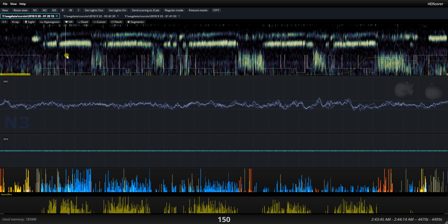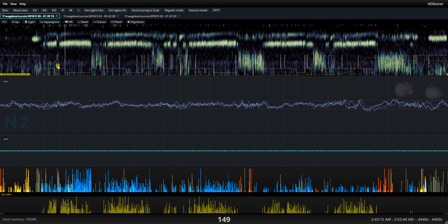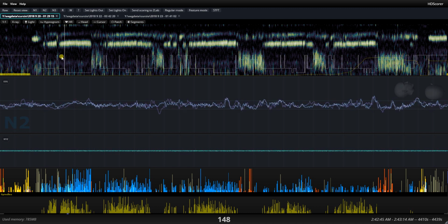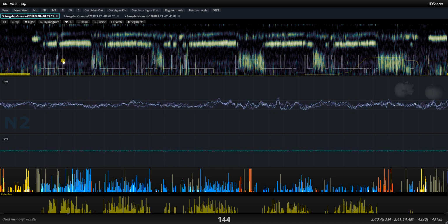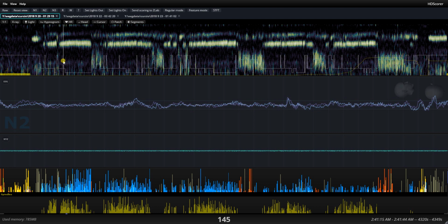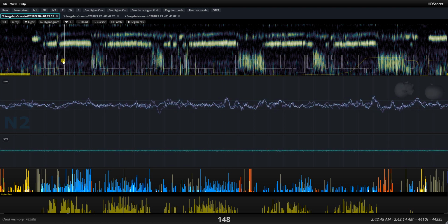Here we're in a transitional phase. This should be a smooth line here. Definitely this blocky transition between N2 and N3 is artificial. But as long as we're going to have it, I think I'm using the most biologically plausible way of determining this. And I think it's going to correlate very well in the majority of subjects with what a human scorer does. Even though the human scorer is allegedly following AASM guidelines, I think there's a very strong tendency visually to do just what I've explained right now.